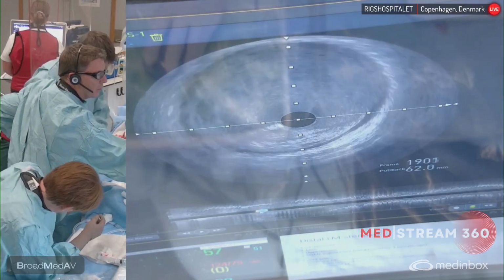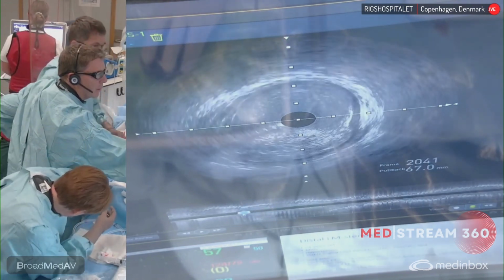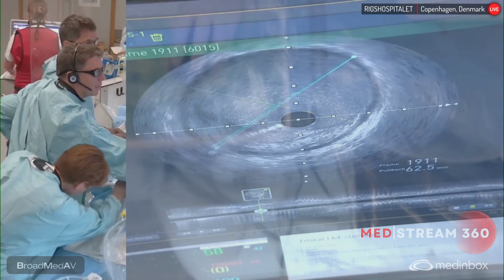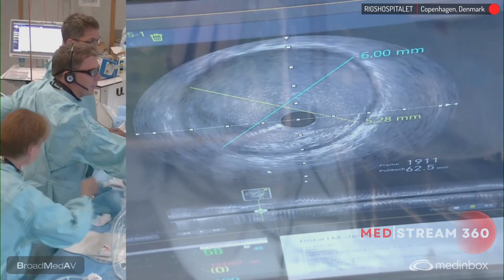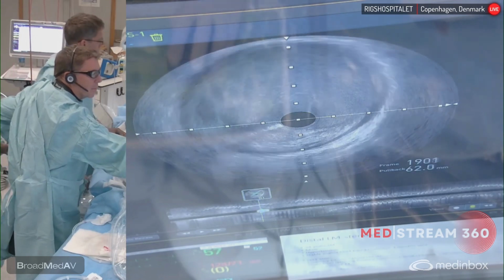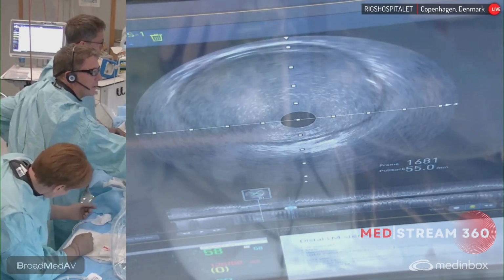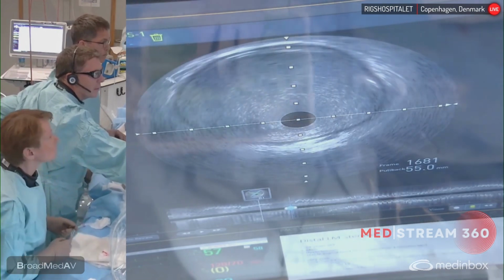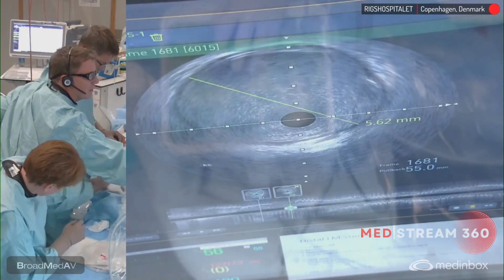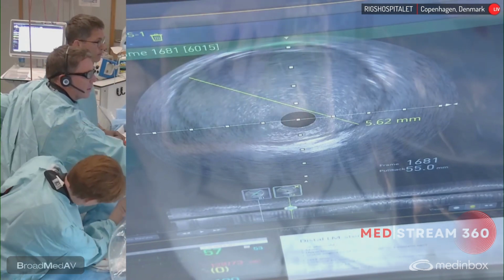Now we're entering, that was one of the diagonals coming in. And here we have the plaque, actually quite a huge plaque, diameter around 5.3, so 5.56, sir. That's the prox LAD. I can just measure it a little bit more distal just to see that's distal to the first diagonal. It's 5.6.